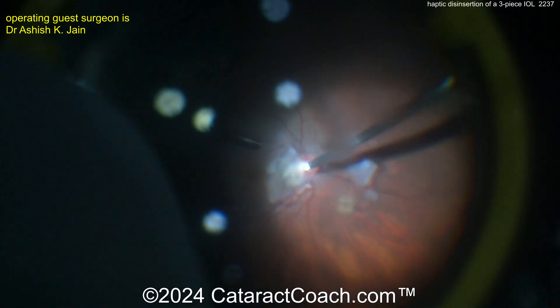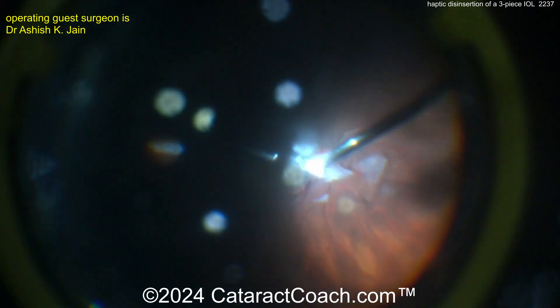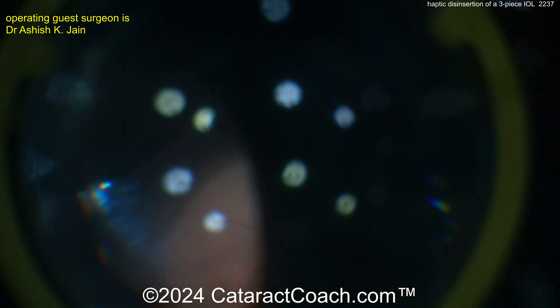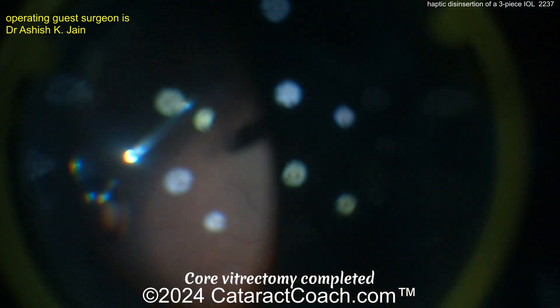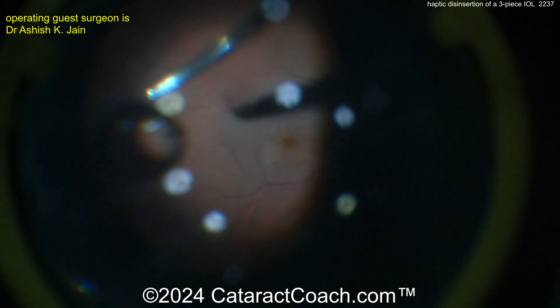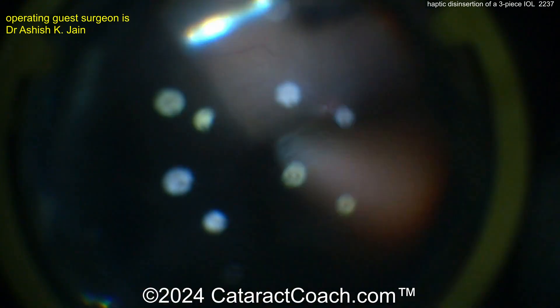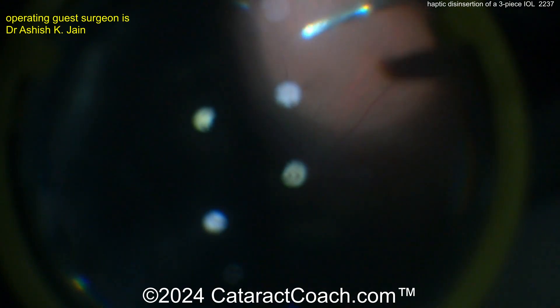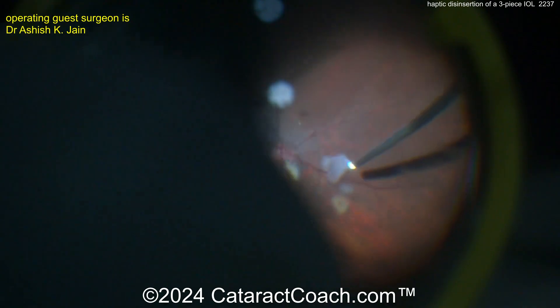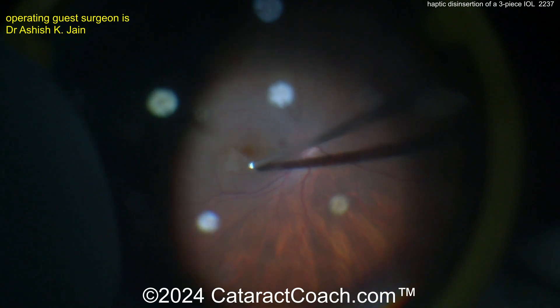That cleans up pretty nicely. I like that the original surgeon had a complication and then referred the patient to this retina specialist — 100% agree. Cataract surgeons definitely get dropped cataract material and ruptured posterior capsule; it happens to everyone. It's about how you manage the case — send the patient to your colleague for the proper pars plana vitrectomy and pars plana lensectomy, and the patient can have a beautiful outcome.